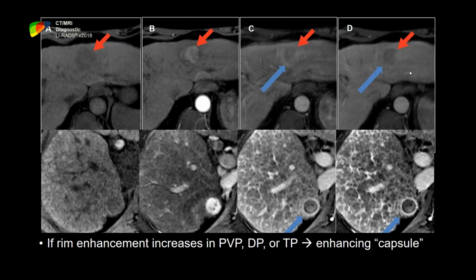There are a lot of factors that go into the decision. But from my personal standpoint, and that's just my personal opinion, we use gadoxetate for cirrhosis in all patients who can get it. But that's not often the practice in other places. So the second question that will come to you is, what would you do with these artifacts that are frequently encountered in the arterial phase with EOB?